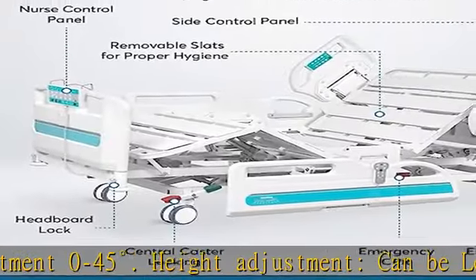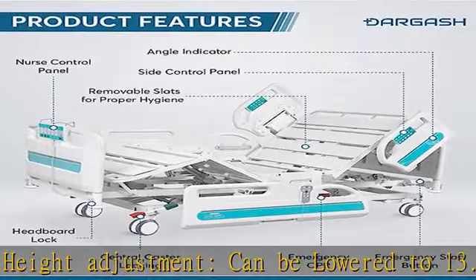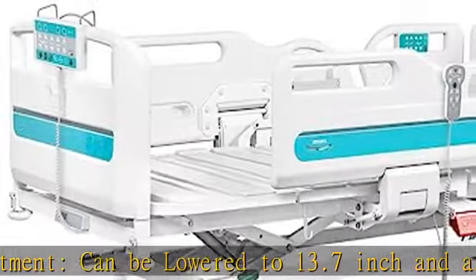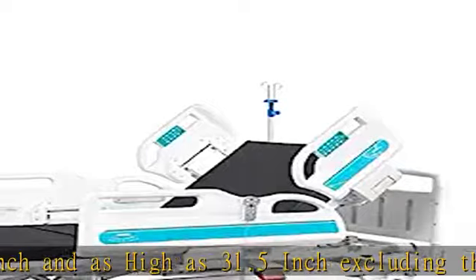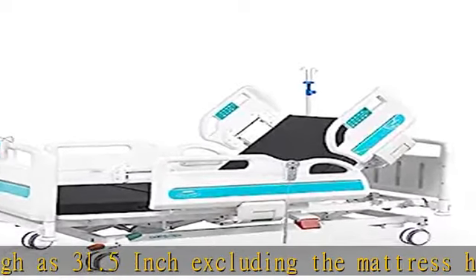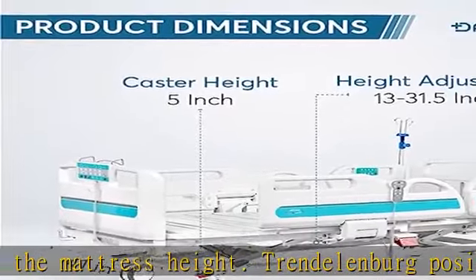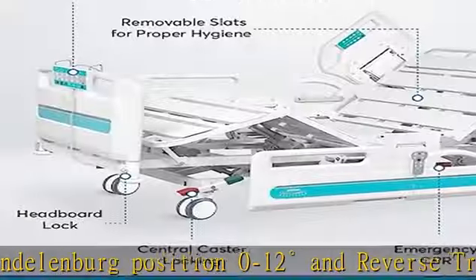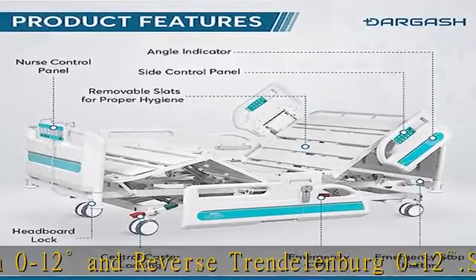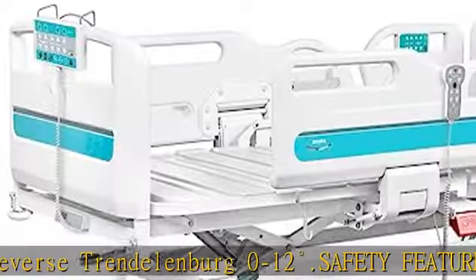Safety Features. This hospital bed offers a full array of safety features. Safety guardrail provides maximum safety to prevent patient falls, featuring a two-step unlocking system to prevent patients from accidentally lowering the guardrail. Electric one-click CPR position, as well as a manual option in case of power outage. One-button emergency stop switch to stop all electric movement in an emergency.